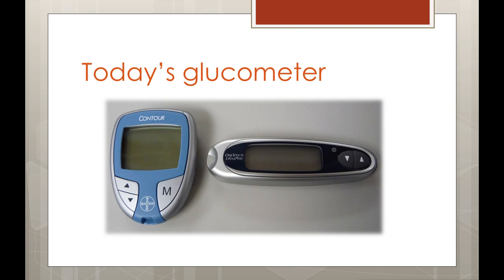Though your glucometer may differ slightly from these, the general instructions and tips we will be going through today generally apply to other glucometers as well. So let's take a look at what's included in our standard glucometer kit.